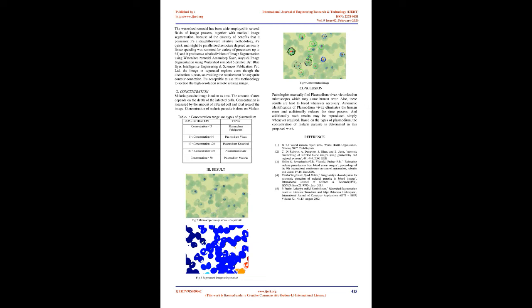Watershed segmentation. It was introduced by Luc Vincent and Pierre Soille, based on the idea of immersion. Every local minimum of a grayscale image I, which may be regarded as a surface containing a hole, is immersed into water. Then, starting from the minima of lowest intensity value, the water will progressively fill different catchment basins of the image surface. Conceptually, the algorithm then builds a dam to avoid a situation where water coming from two or more different local minima would be merged.